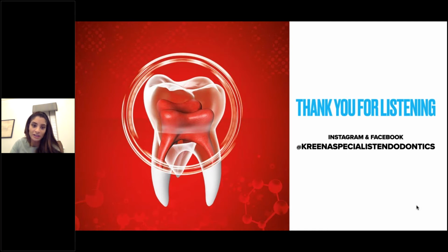So place a cotton pledget which has been soaked in sodium hypochlorite. When you remove it after 2 minutes, if you still have bleeding, then I would take a couple more millimeters away, so another 2 millimeters, and repeat the procedure, because a healthy pulp shouldn't bleed too much. It should have 2 minutes and then it will be okay.